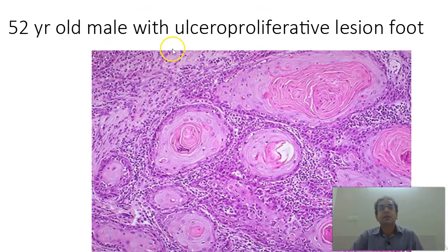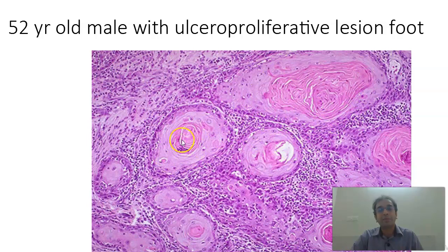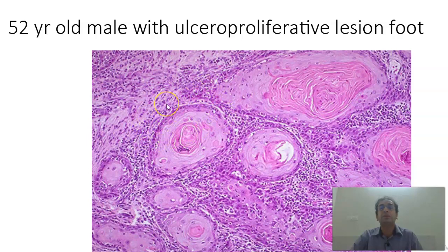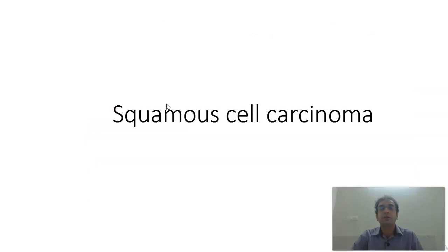Next case is that of a 52-year-old male with an ulceroproliferative lesion in the foot. What you find here are islands of epithelial cells which have keratin pearls — epithelial whorls with keratin pearls inside. There are well-defined nests and it is infiltrating everywhere. This is a squamous cell carcinoma — from the look of it, a well-differentiated squamous cell carcinoma.